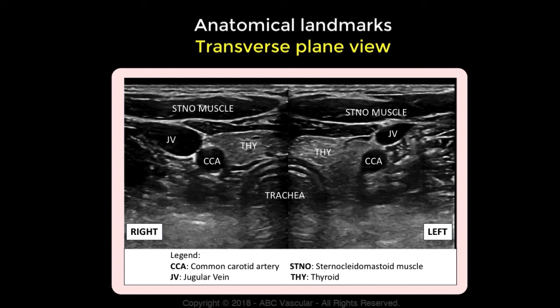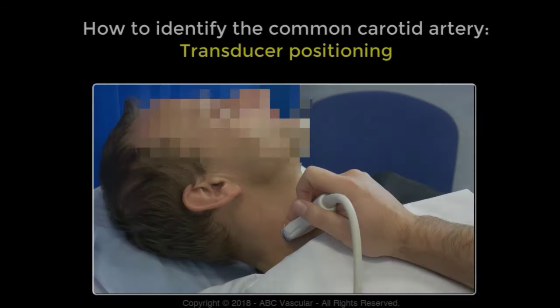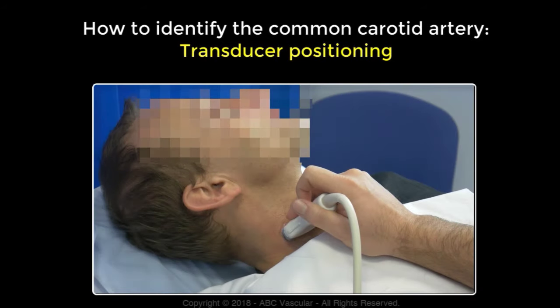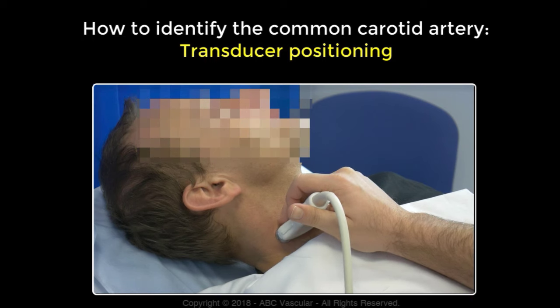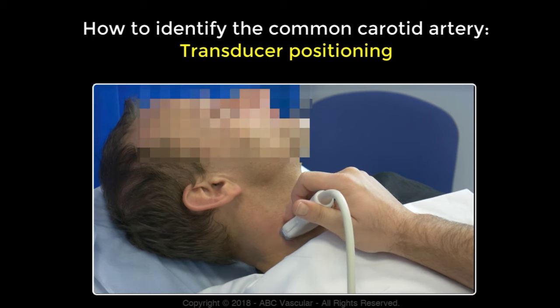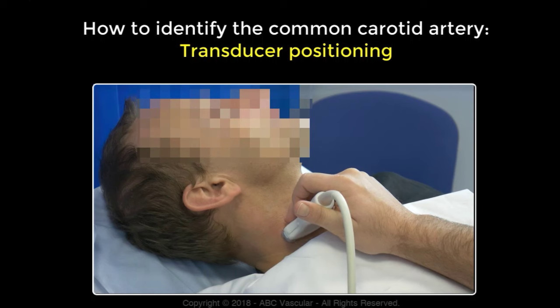In the next section of this video lecture, we will demonstrate how to position the transducer on the neck of the patient and the ultrasound appearance of the anatomical landmarks used to identify the carotid arteries. To identify the common carotid artery, position the transducer using a transverse view in the medial aspect of the neck, between the sternocleidomastoid muscle and the trachea. When positioning the transducer at this level, the proximal region of the common carotid artery will be visualised.